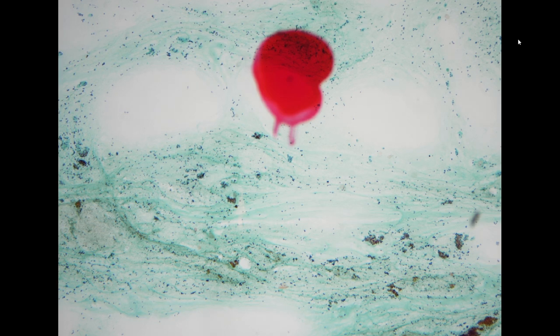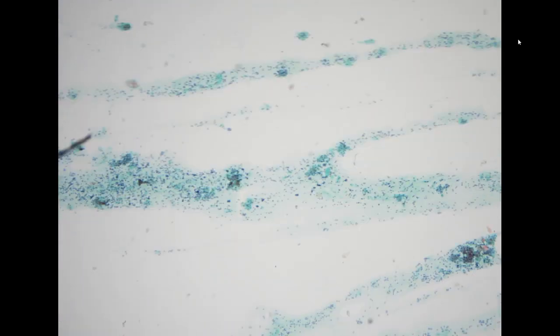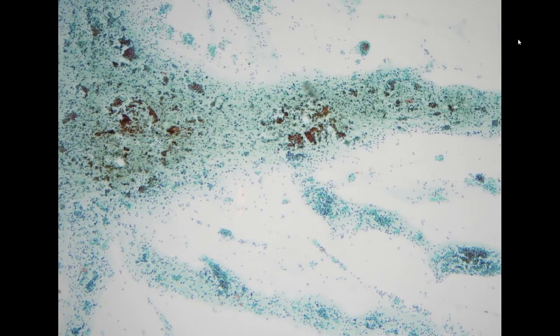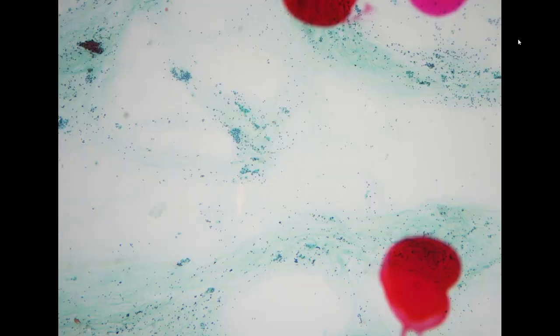It could be coming from the endometrium, but if it is not a type 1, endometrioid type tumor, it can show these scattered highly atypical cells in the smear, or it could be coming from an extrauterine origin. It's a little bit difficult to tell, and we do not see a very obvious bloody smear in this preparation.